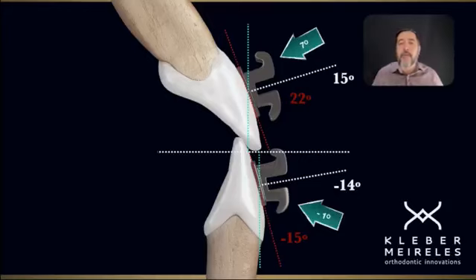And we know that for each 0.001 inch of difference between the height of the slot and the height of the wire, we have approximately 4 degrees of play. So a lot of play if we're using this combination, 22 slot, 16 wire, so we have a lot of play. This won't change. But if we insert 1925, things are going to be different because it won't cover the play.